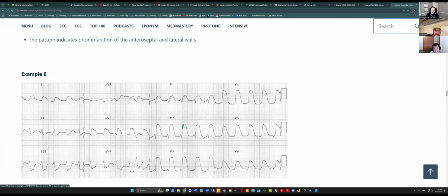how did you guys know right off the bat that these were all ST elevations? I want you to be able to explain it. Going off the baseline, they're significantly higher. Good. So you can see the baseline here, right? Because here it's kind of hard to tell. It's like, gee, where's the baseline? They look like tombstones. Exactly. If you know this is the QRS and this is the baseline, that's up. Now you can start seeing the morphology. That's baseline. That's up. That's up. That's up.